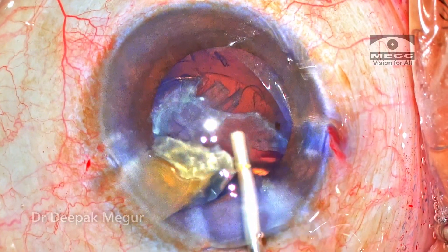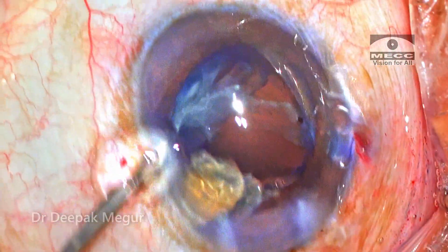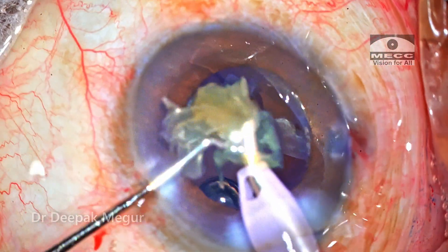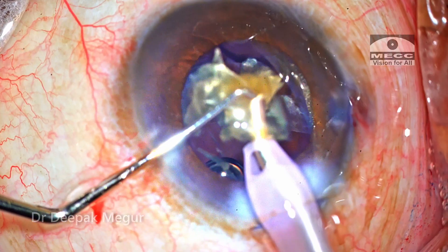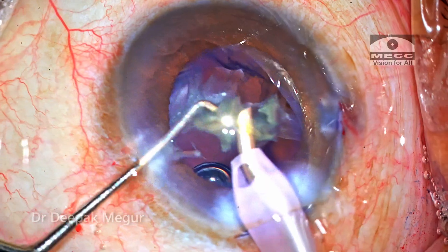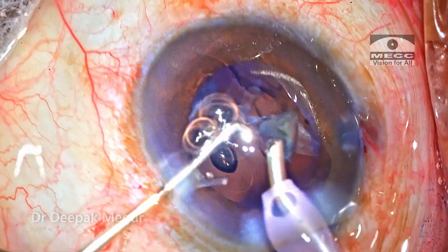Again the OVDs are injected — dispersive OVD goes in first, followed by HPMC underneath it. The second fragment is similarly emulsified. It's going to take some time because I'm going to be very slow and gentle. The two fragments are emulsified quite safely.